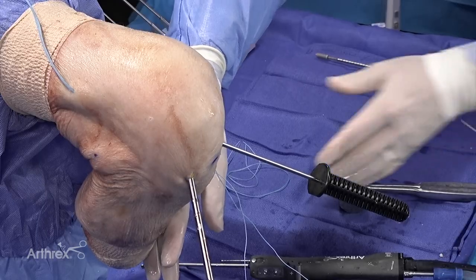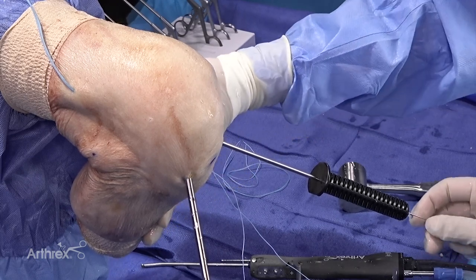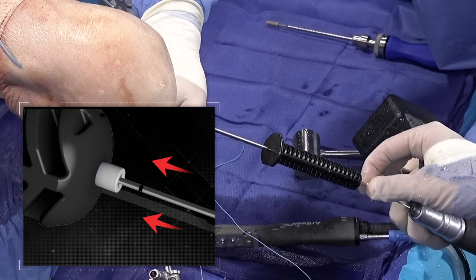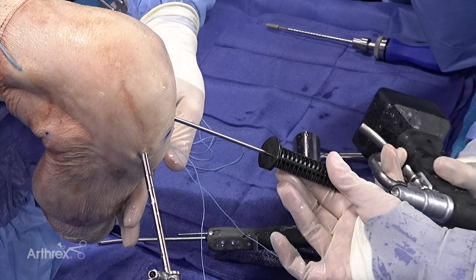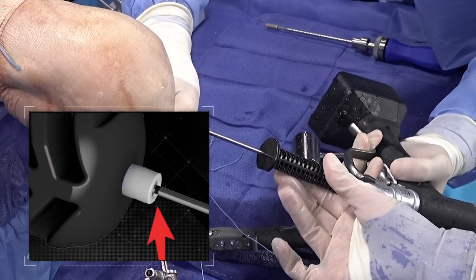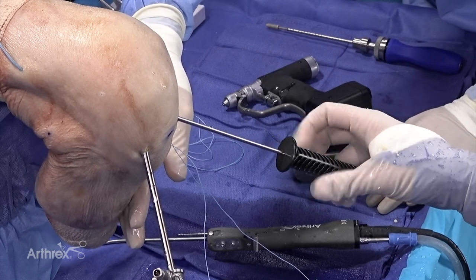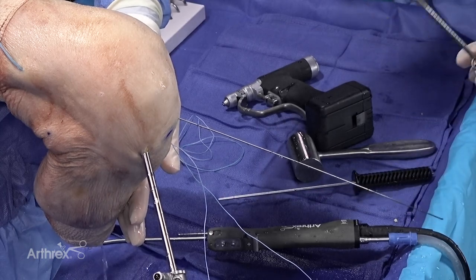Now we're able to advance the trocar tip wire. We advance it from the back — when it bottoms out, we know we're about a centimeter shy from the back of the handle. We slide in the wire driver and advance it about a centimeter to maintain its position. The wire stays in and the dilator comes out, which maintains the orientation of our wire to advance the screw.